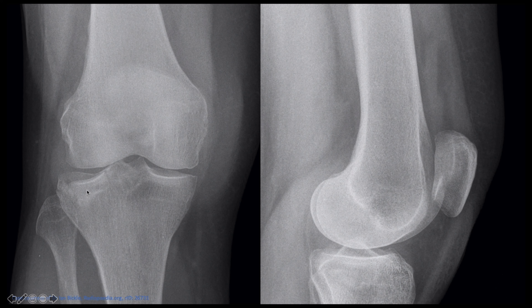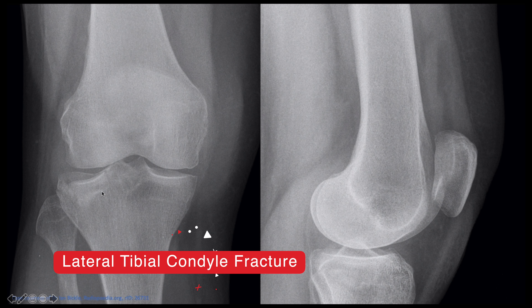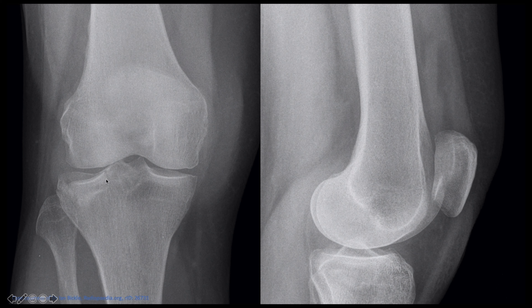This is an AP and lateral radiograph of a knee. The first thing that catches my eye is the presence of a large lipohemarthrosis - there's a fluid collection in the suprapatellar bursa. You can see an area of low density which is the fat, and an area of higher density corresponding to the blood. Once I see this, I know there's a significant traumatic injury and I look carefully around the bones for fractures. Looking at the AP radiograph, you can see there's a lateral tibial condyle fracture, and there's a dip of the lateral tibial plateau with increased sclerosis - this is a lateral tibial plateau fracture.